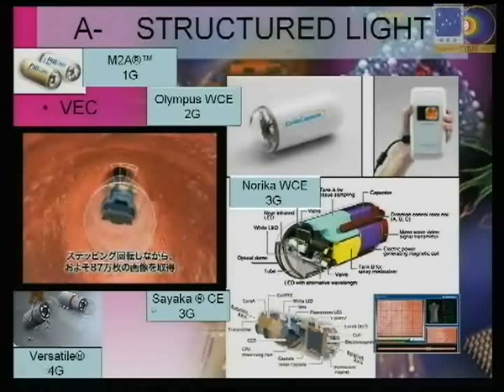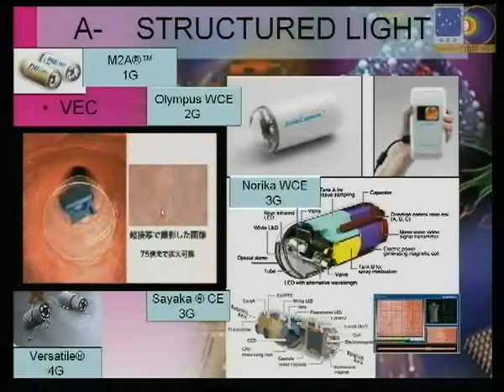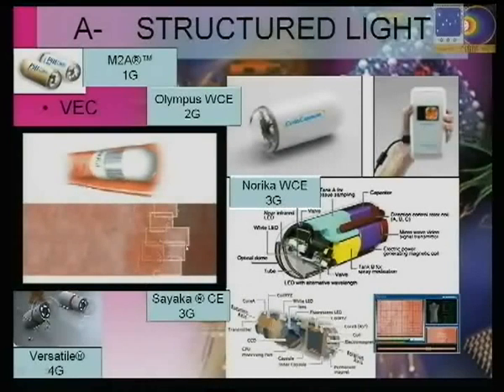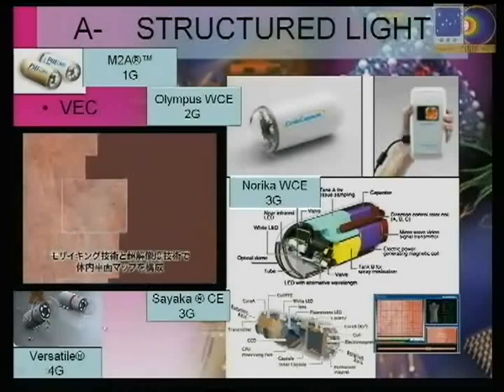Taking pictures of all around. The speed is very high, and you are taking different pictures. You are sending the pictures outside. Obviously, this is a wireless connection. And in the system outside, the pictures are built into a mosaic form.